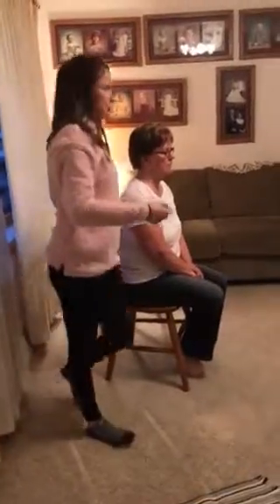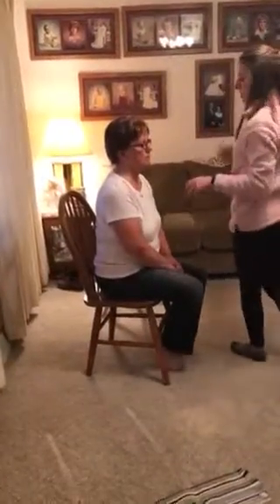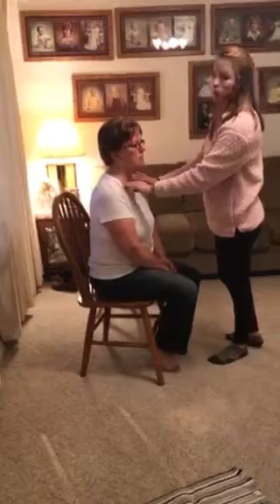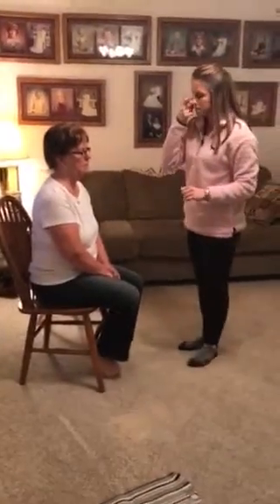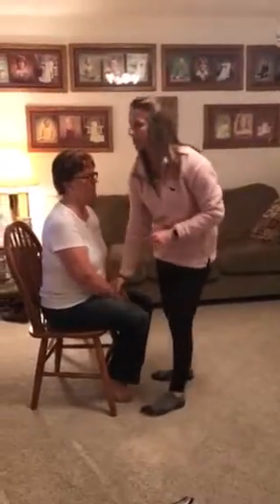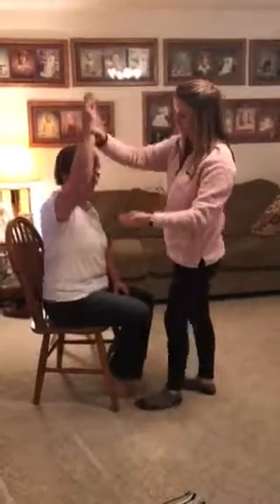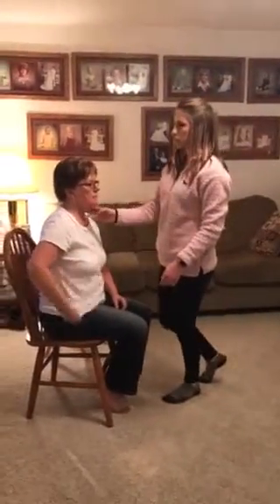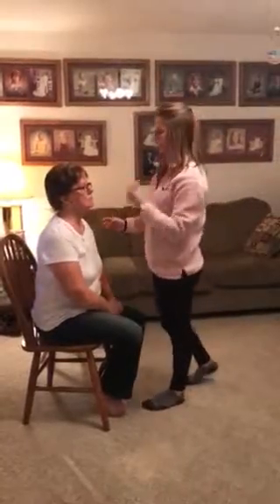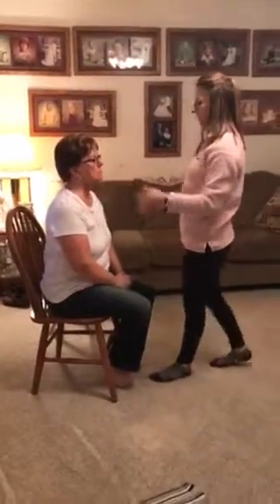On the anterior side of her chest, she has 10 spots. You want to start those above the supraclavicular and go down. And then she has 4 spots on the side. So if you want to raise your arm above your head for me, listening right here in those 4 spots again on both sides. And then I would listen to your trachea with the bell of my stethoscope, and I would listen on both sides of that as well.